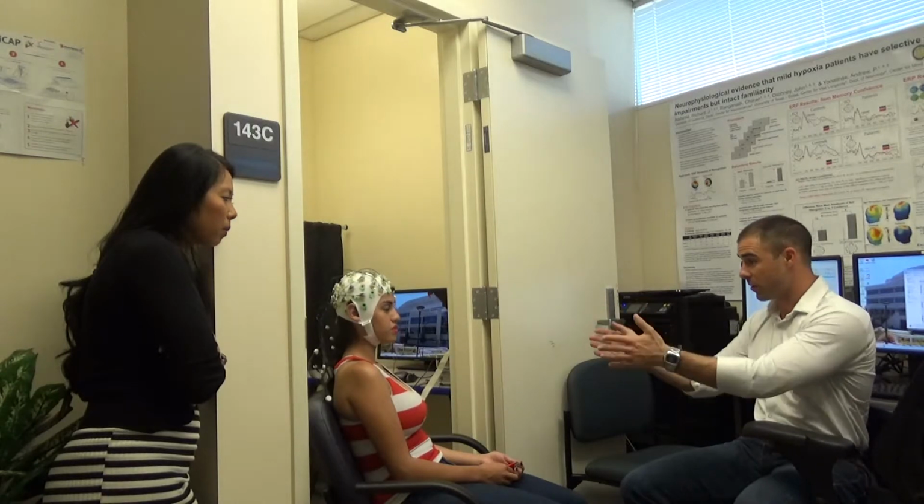So first what we want to do is remind them to just hang tight and sit still. Then I'll rotate you back around a little bit and we'll get some slack in the wires. The first thing I'll do is unplug the wires so that you have some mobility back. Then we'll take the electrodes off the face, then take the electrodes out of the cap, and then take the cap off. Get the bucket. First we'll clean up her, then we'll clean up the electrodes, and last we'll clean up the cap. As I mentioned earlier, it's one of the most important parts, because we've really got to clean up our stuff today if we'd like to use it in a new way tomorrow.